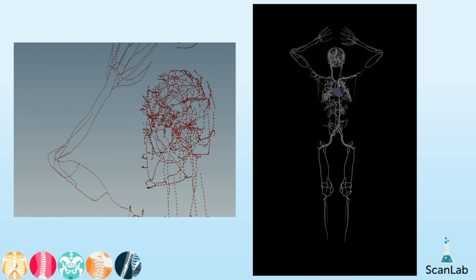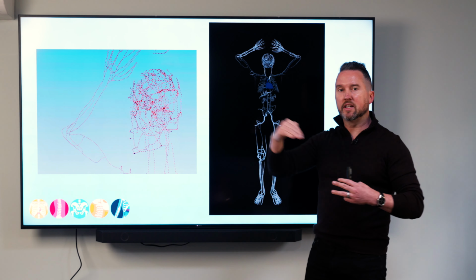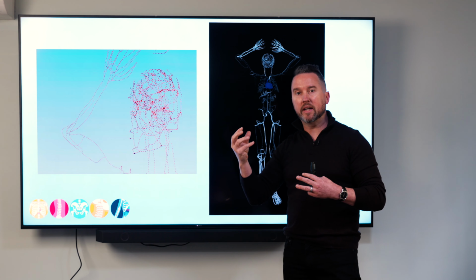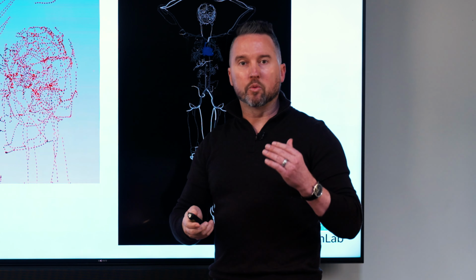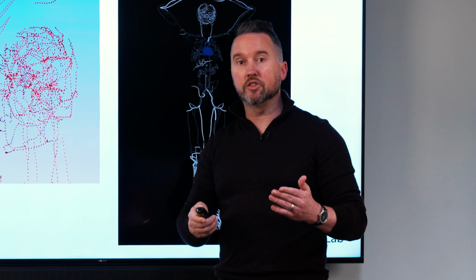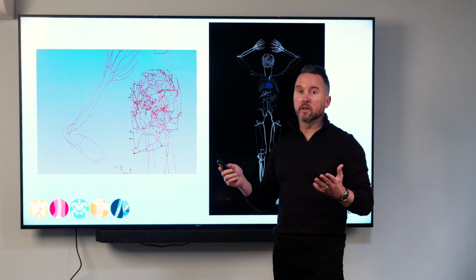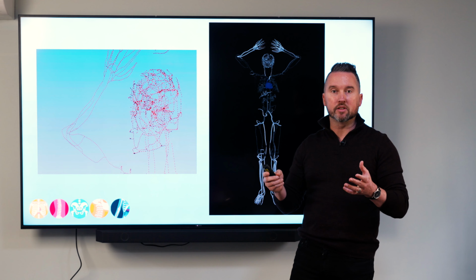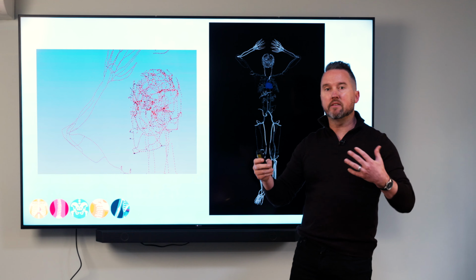This has also never been done before, but we came up with some new problems. At this point, the contrast would just go to the fingers and then come back. And also the beating heart that we were able to give the patient, it beat the same every time. So if you're looking to mimic real human life and real human physiology, this would become very predictable. And that's what we don't want, because the thing that makes MRI and CT special is the patients. And each one of those patients, their heart beats differently, they breathe differently.